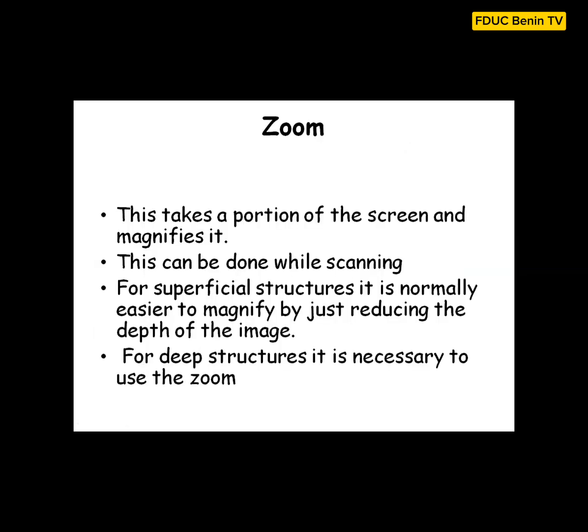Now, another button that I want to quickly talk about is the zoom button. The zoom knob helps you take a portion of the screen and magnify it. Maybe an area that you are interested in, you click on it, and that particular area can now be magnified, blown out, big enough or large enough. You can do this as you are scanning.